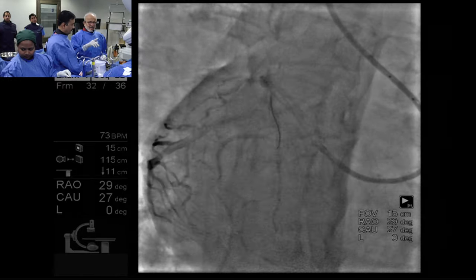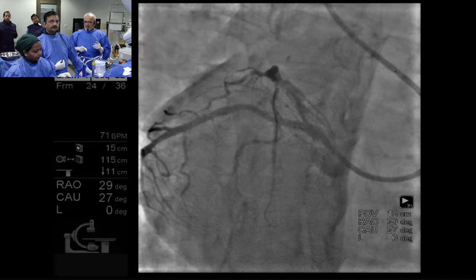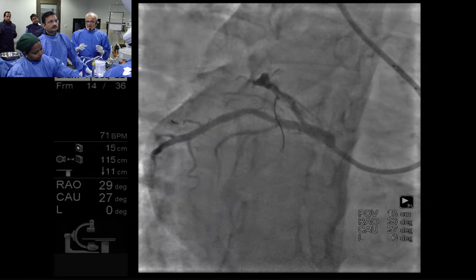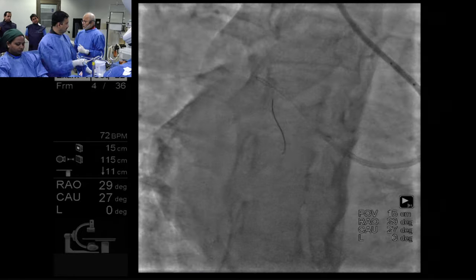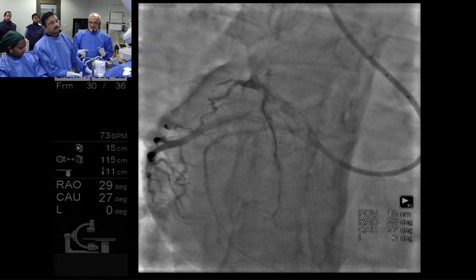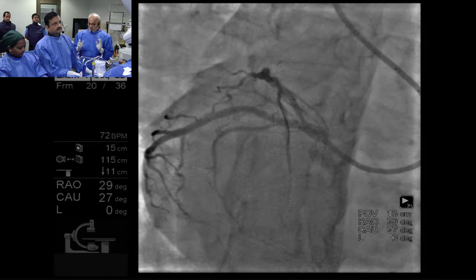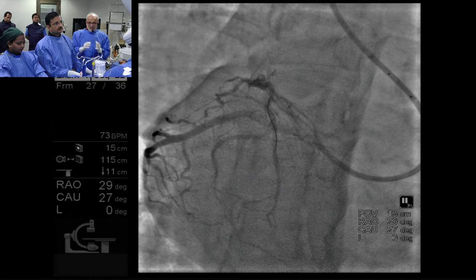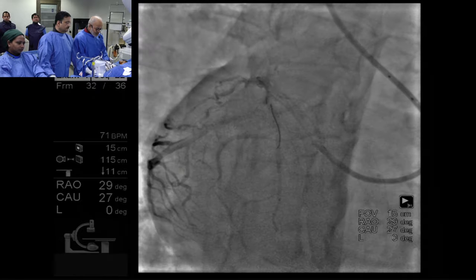Here I selected IVL keeping something in mind. If it is a completely normal area which has some nodule, then I would love to use Wolverine, because most of my IVL pulses will be wasted. But if there is a diseased area with that uniformity, this is my hypothesis, it delivers proper pulses to that area. So let us see.